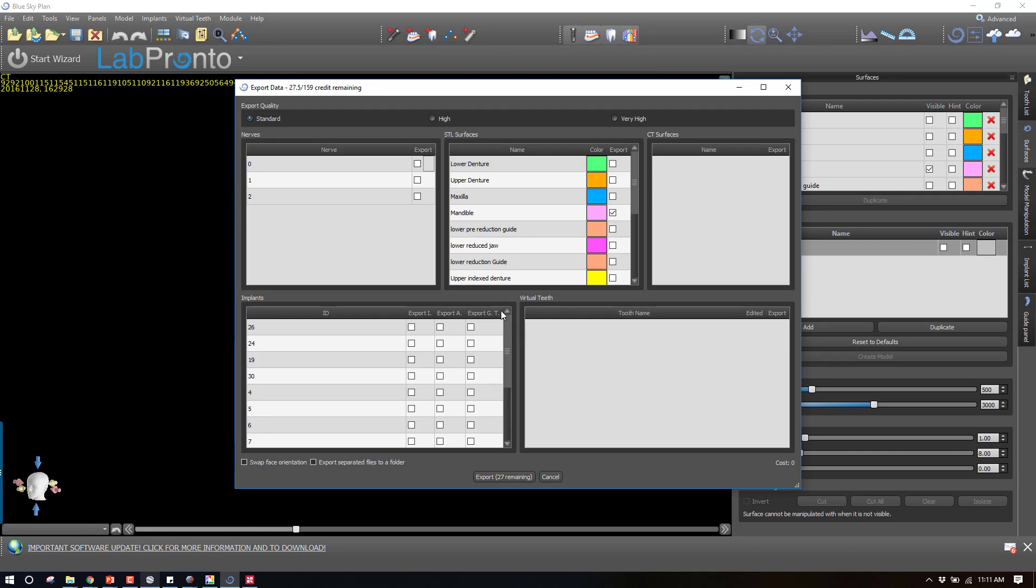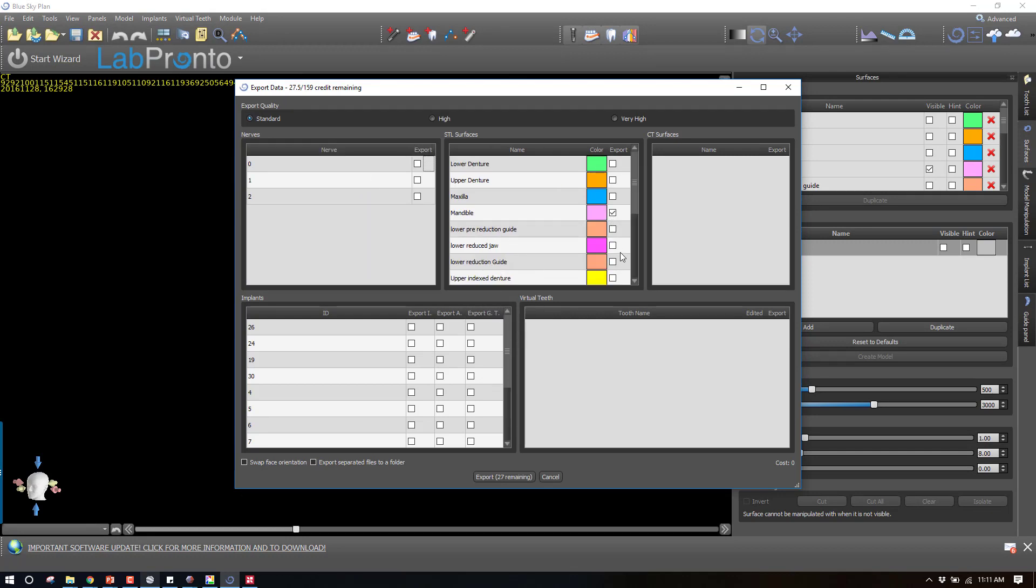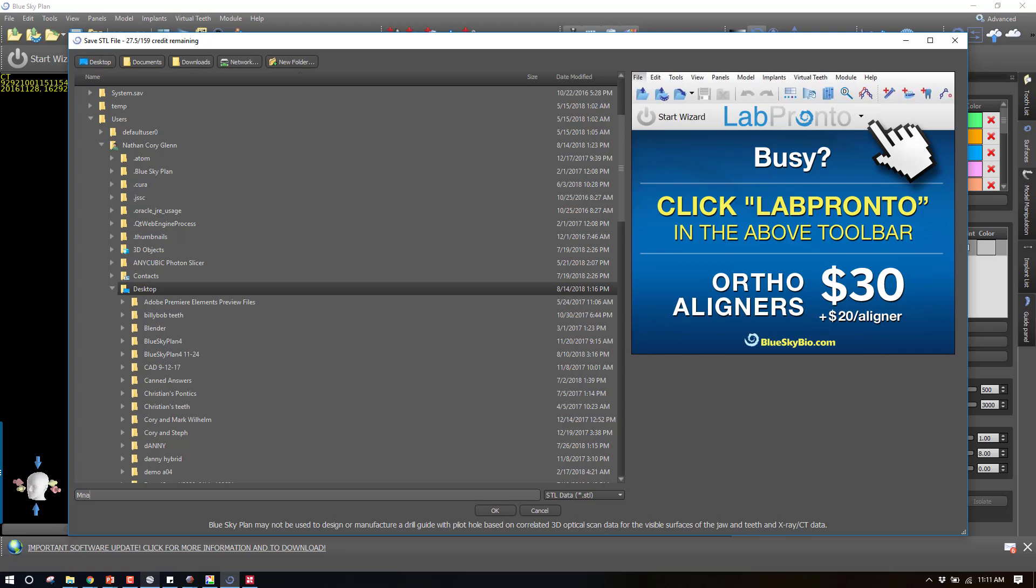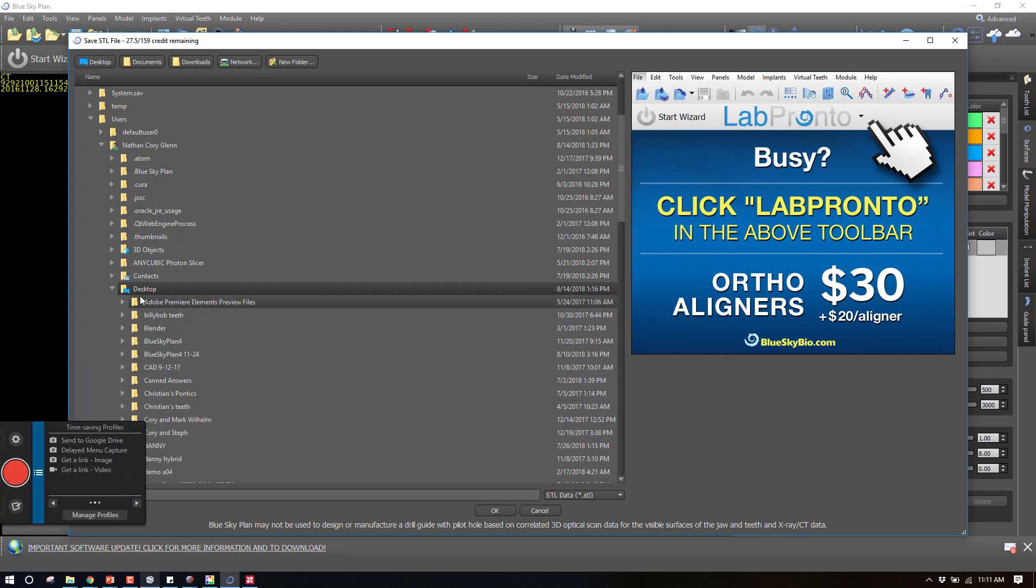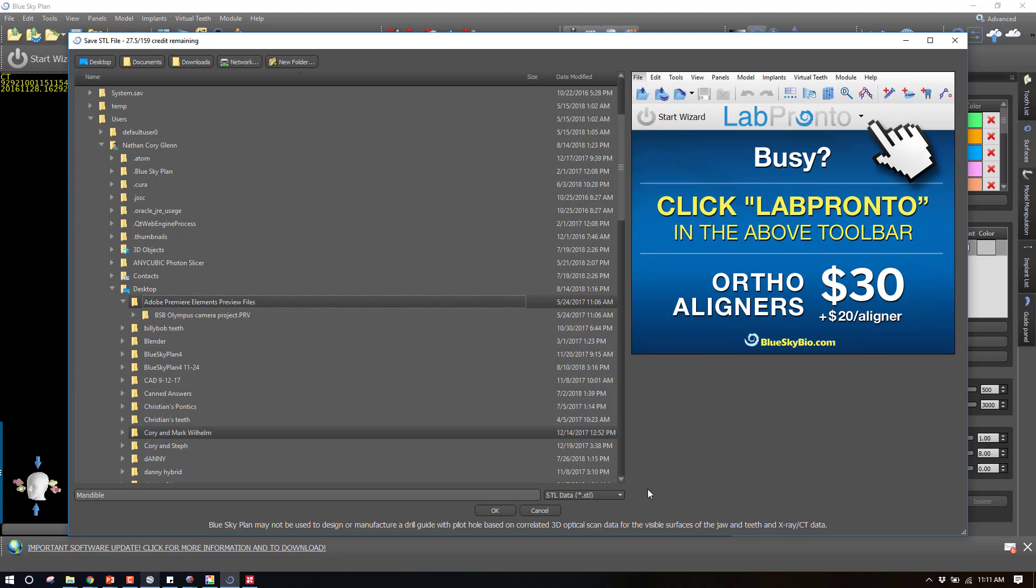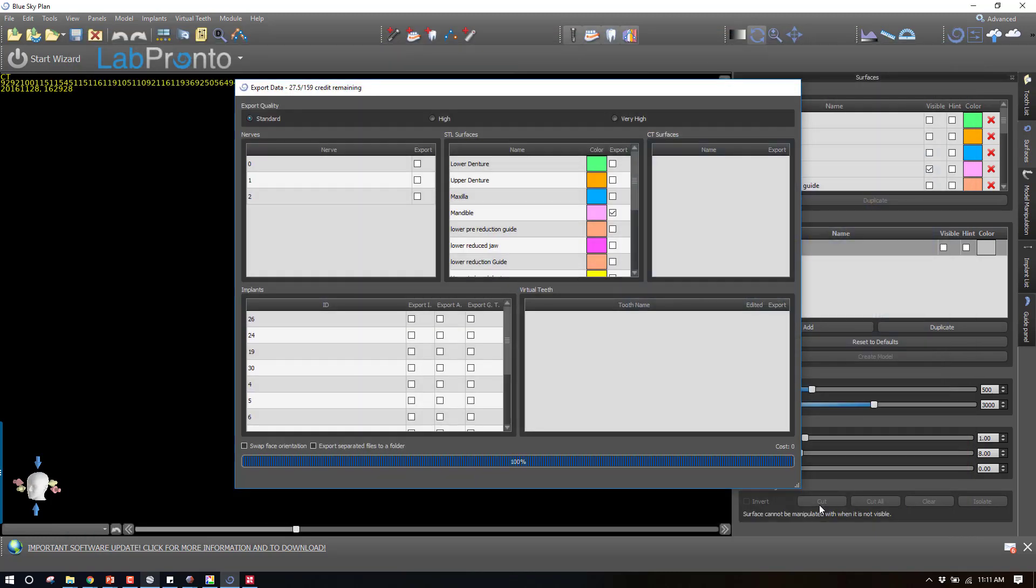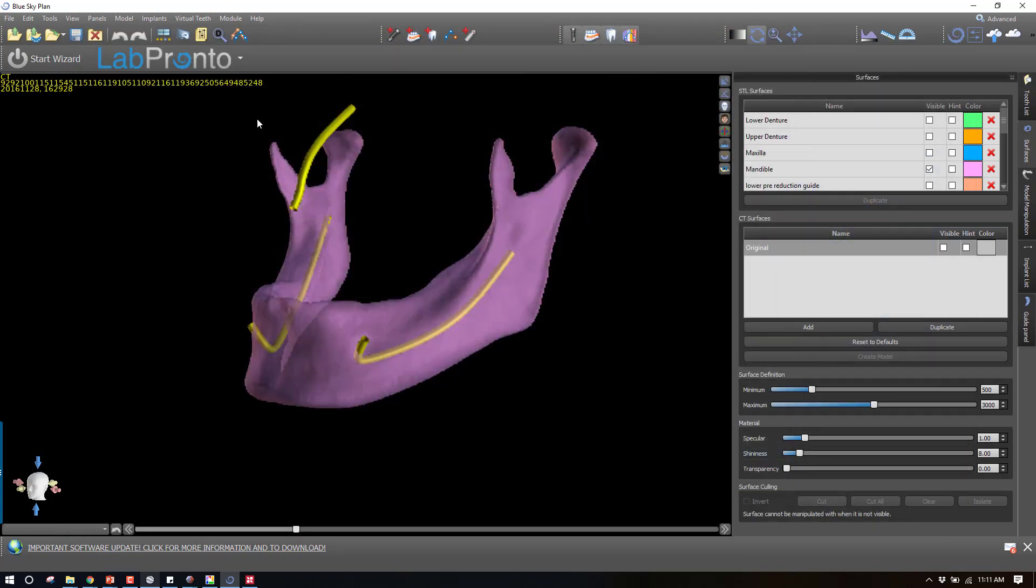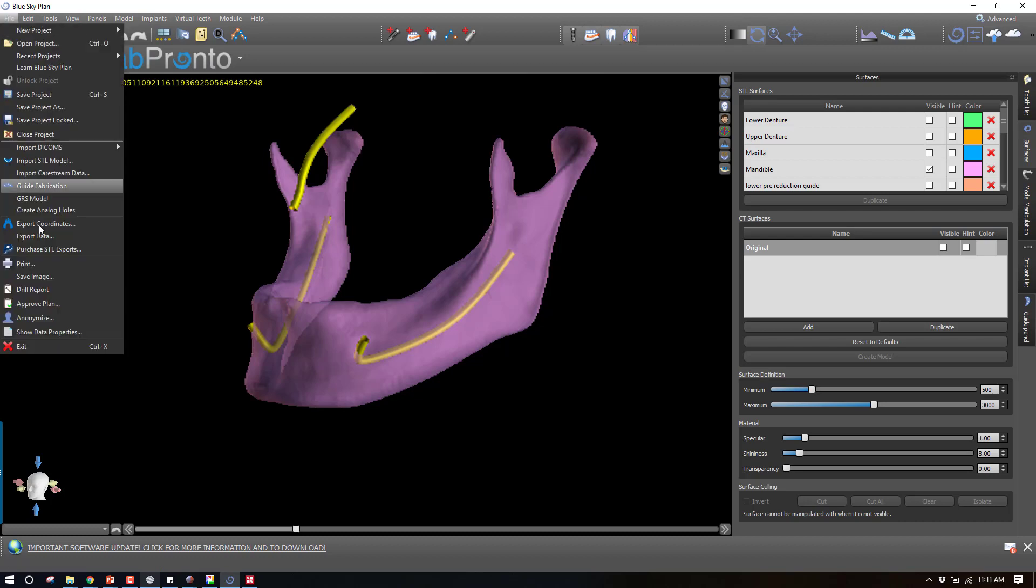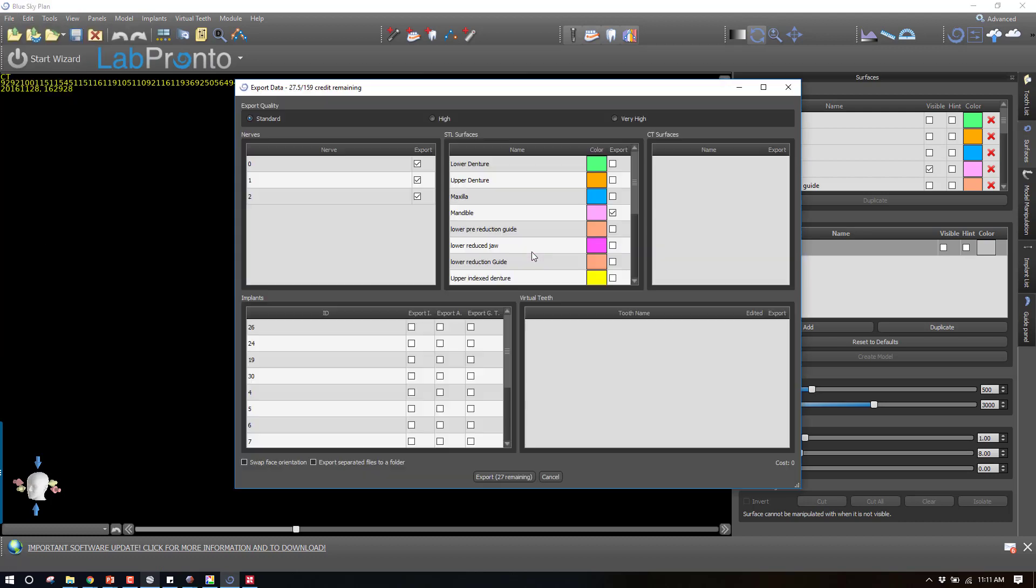Go to Export Data. First thing I want to do is export the mandible. You can see I've got a bunch of STLs. Check everything off except for the mandible. Name this, save it wherever you want it to be. I'm going to put it on my desktop and just call it mandible.